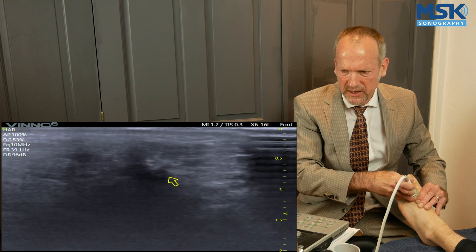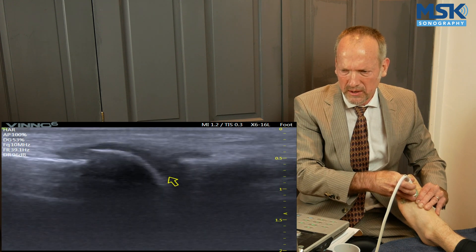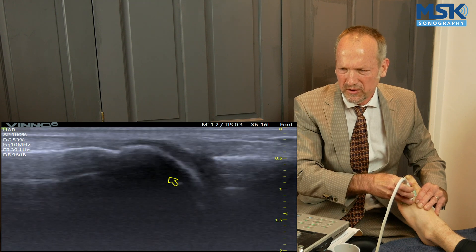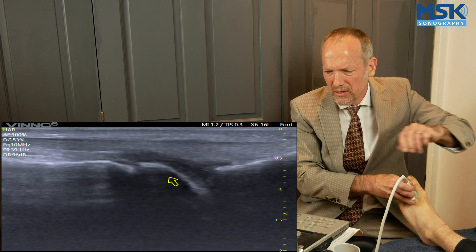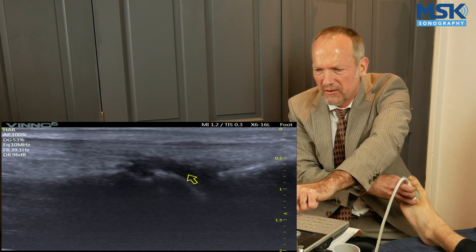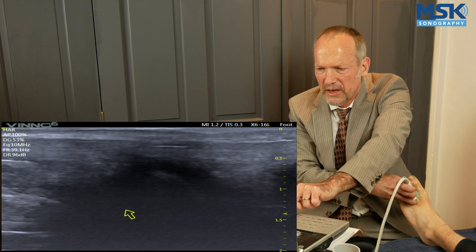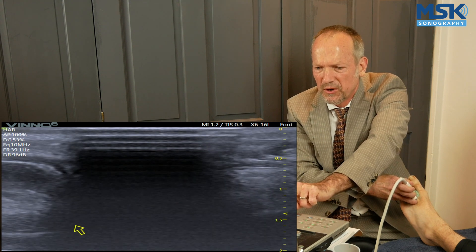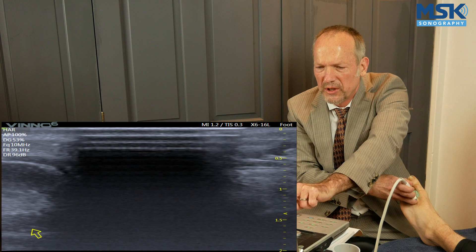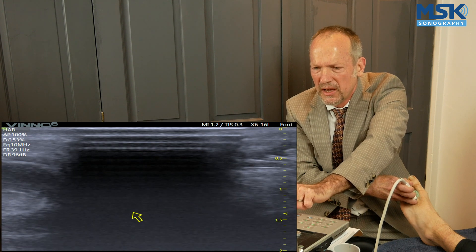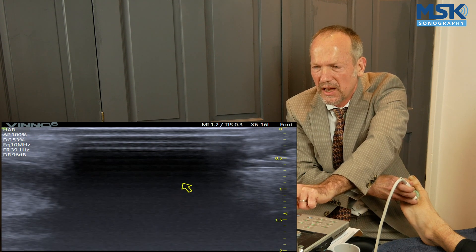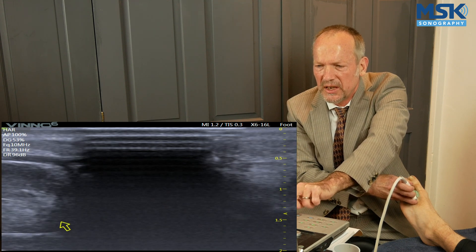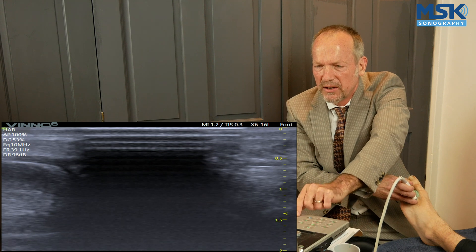You might have to, with each patient, scan through a few times just to get that line as good as it can be. Then the region of interest in the space is just this area here. As we're discussing with the anatomy, the nerves should follow from proximal in the deep field. As we go distal, it'll become closer to the near field. So we can already see some structures around this area.